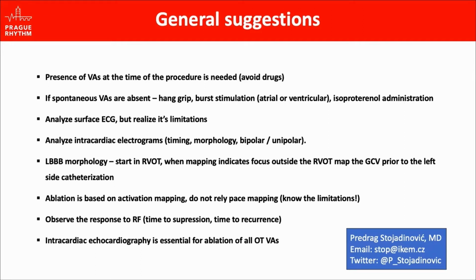And most of all, I would like here to emphasize the role of intracardiac echocardiography that is essential for ablation, not only for the outflow tract ventricular arrhythmias.